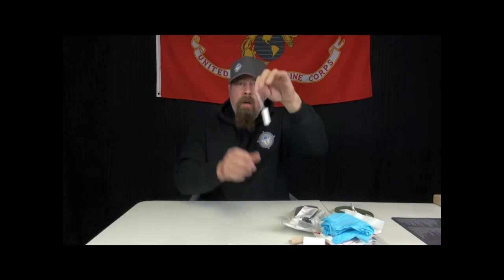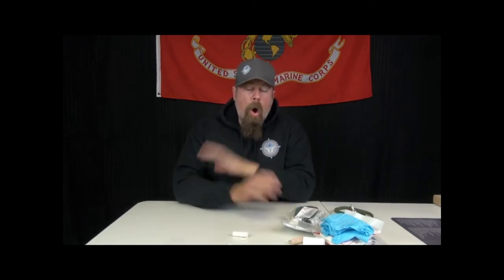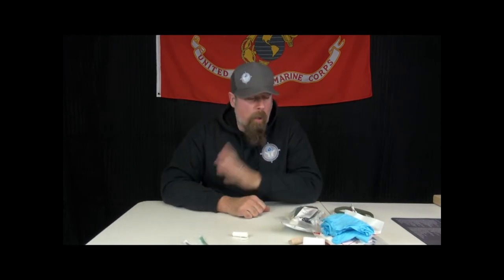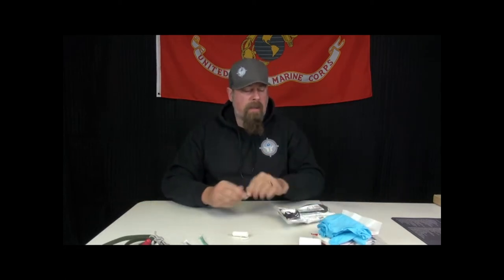And one of the things that the 18 Deltas always had in their kit, in addition to the normal issued stuff, was these right here. These maxi pads and tampons. Out of all the stuff in this kit, I've got a stainless steel, 14 gauge decomp needle, right? I've got a nose hose to go inside of your nose, all the way back to the back of your throat to maintain an open airway. I've got tourniquets, right? I've got duct tape, all that stuff.